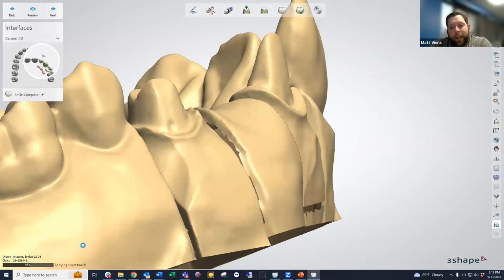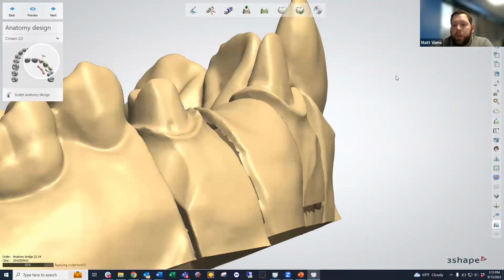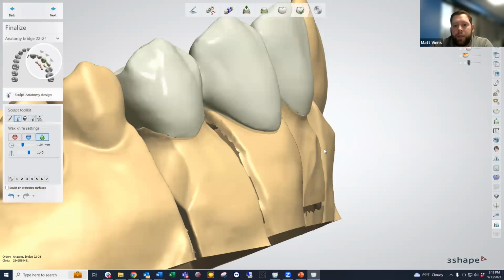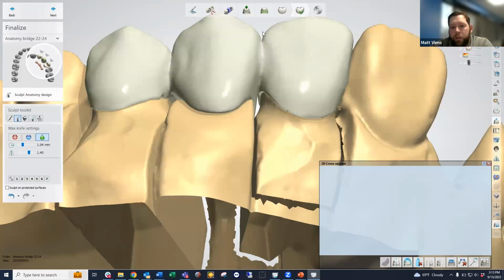Since I had to do a lot of changes because my design was not so good, it's going to take into account how long it took me to make those changes and apply those individual clicks. But once we go into the final stage, like I said, with the 2D cross-section tool, we can draw down the interproximal and highlight just the area that we're looking for. So you can see this is our tooth over here. This is our model in the 2D cross-section, and that's the area that we've cross-sected or dissected there.